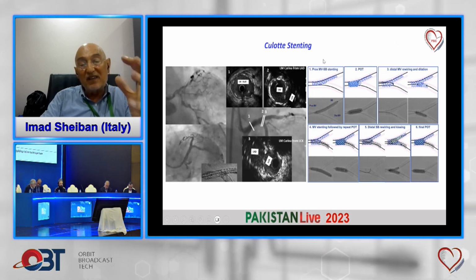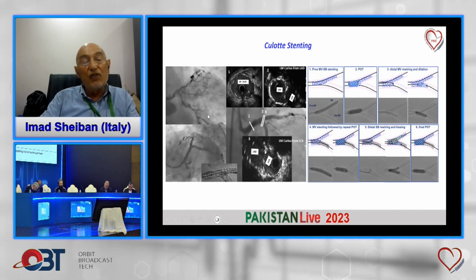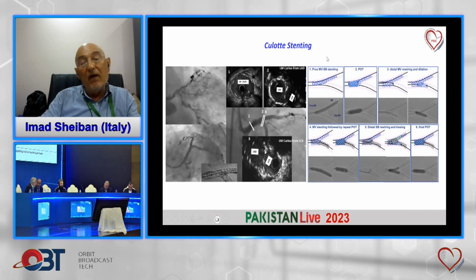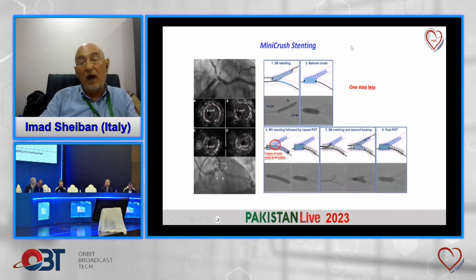by step, that means a stepwise approach with intravascular imaging, I think if you look at the final result, both on angio or intravascular imaging, you will see that you can get a good result for each two-stent strategy or provisional stenting as well.